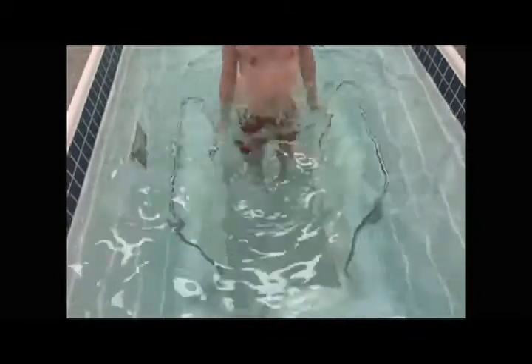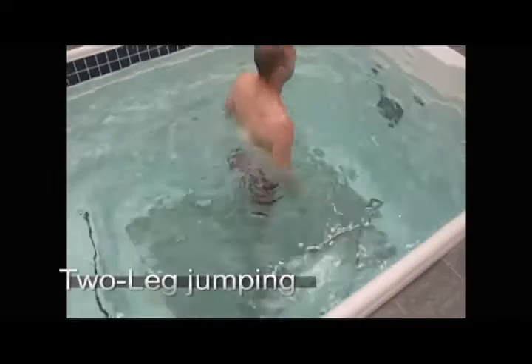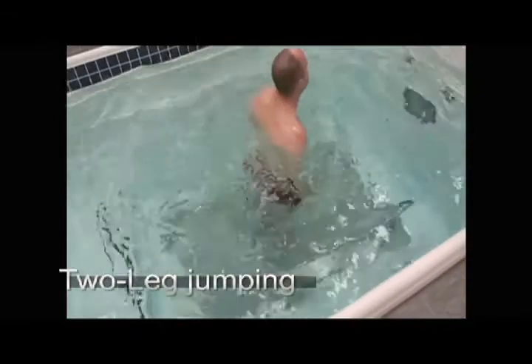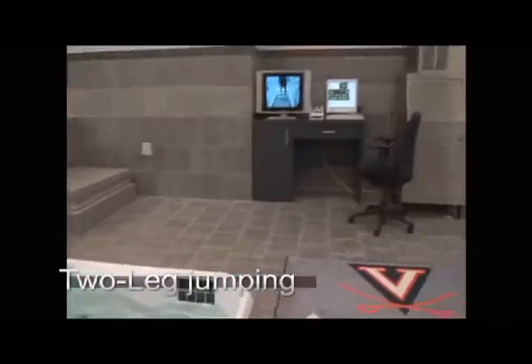We slowed the treadmill down to a complete stop and worked on some double-legged hops. Since he was just a week post-op, we emphasized jumping off two legs and landing on two legs.